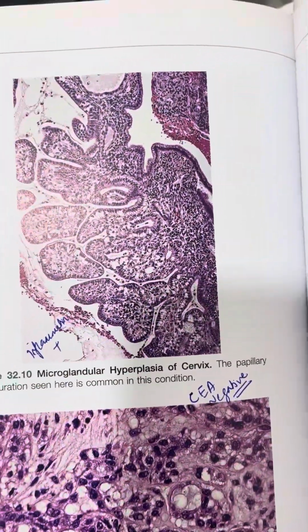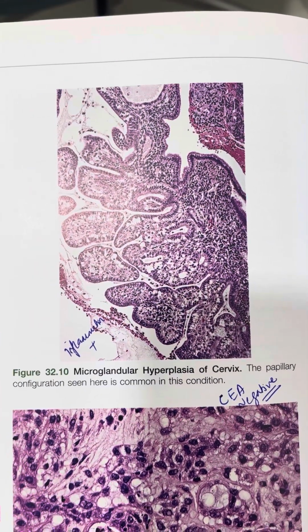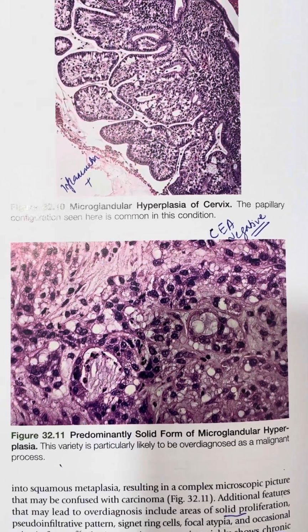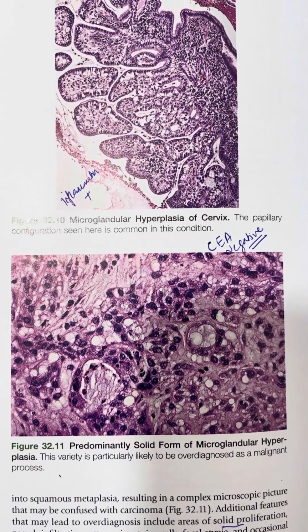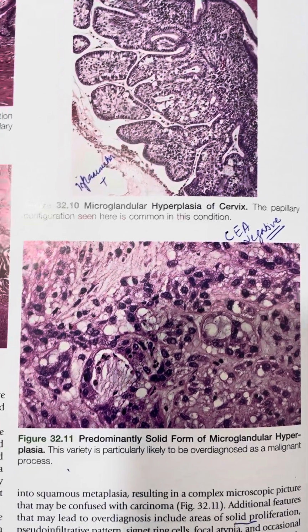Then this is a microglandular hyperplasia. An important clue to the microglandular hyperplasia is the presence of inflammation. Sometimes they can be solid, so then you have to do the CEA. CEA will be negative in microglandular hyperplasia, differentiating it from adenocarcinoma.